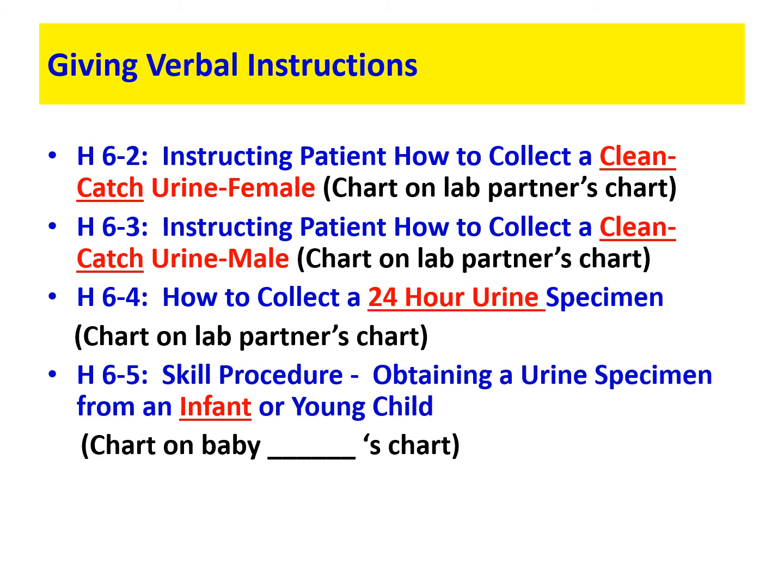Now, same thing with the infant. They have special collection devices for infants. And so what you would do is you would give this special collecting device to the patient, to the parents, to take home with them to collect. Or sometimes you can go, if the patient is there, you can go into their room and you can apply this to the patient, okay? And it's set up specifically for boy or girl infants.